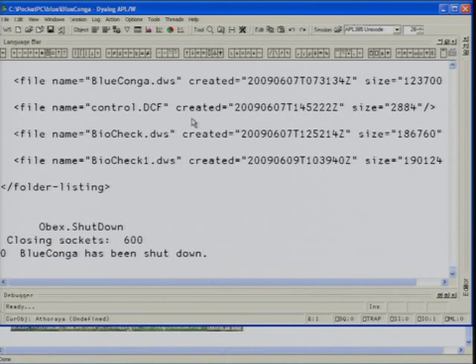Bluetooth isn't really designed to be secure. They've got security plans and security protocols, but it's not very powerful. The other thing about it was using the existing technology, so you didn't have to have permanent connections. If you're on a train that goes into one of the many tunnels around here, the central system isn't going to start sending an ambulance to the next station because you've stopped sending. It's just going to retry after a while, with various tolerances built in.